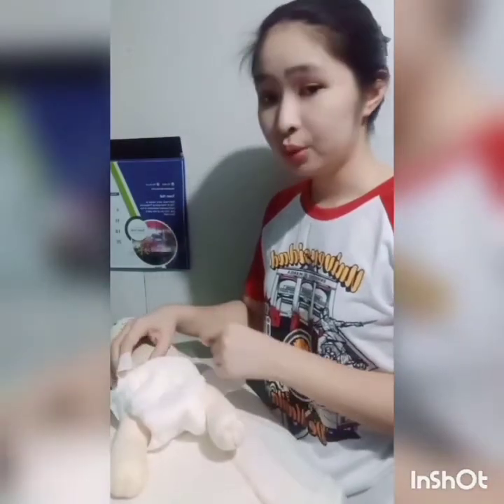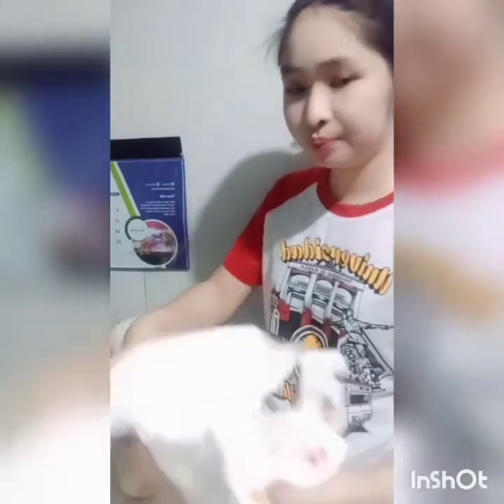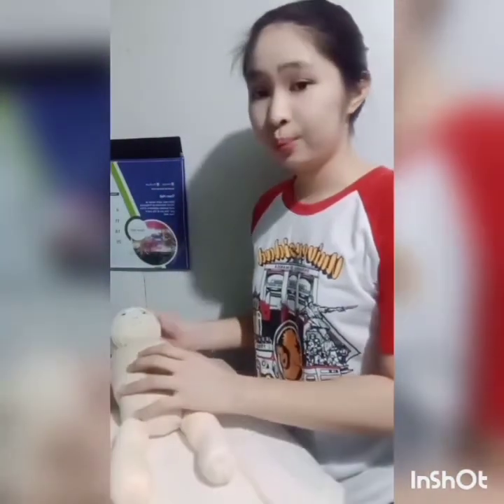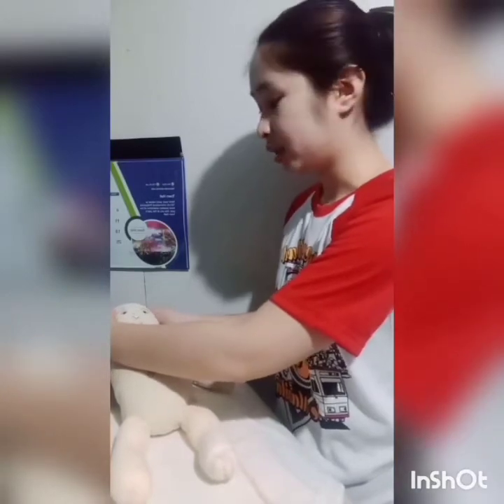We're going to remove her diaper first, and remove their dresses.